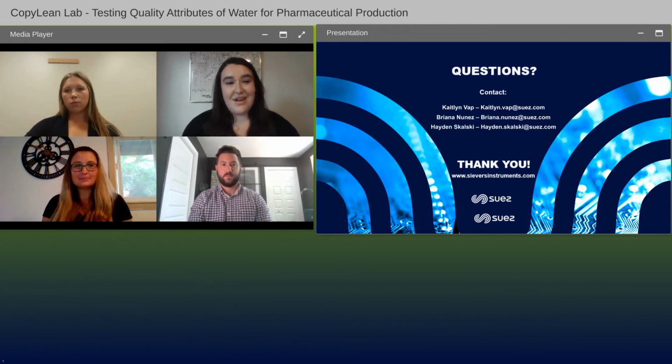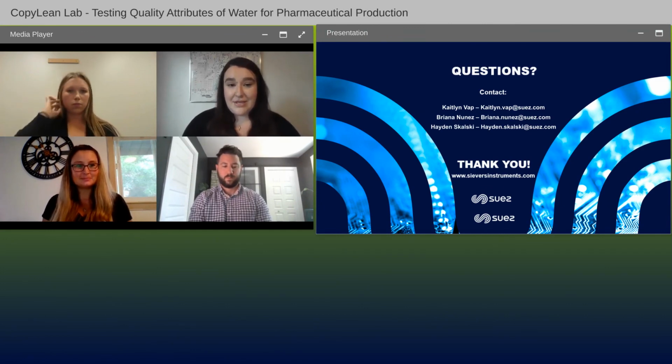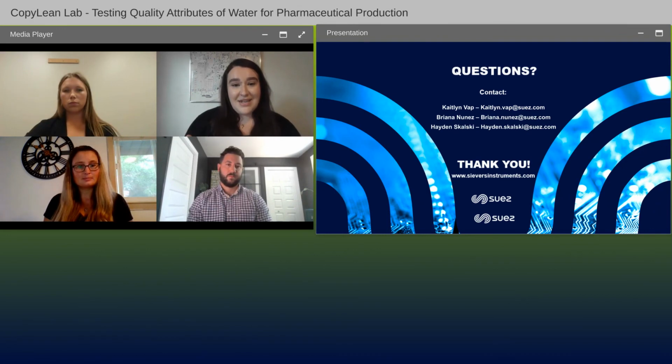Great question. Yes, some rapid bioburden methods have been validated for specific applications by end users. They're generally deployed as a monitoring method in conjunction with compendial testing. The reason we still do compendial testing is that it allows for the accumulation of data and results and the ability to compare correlation, and then at the very end have a decent amount of data to set new acceptance criteria.